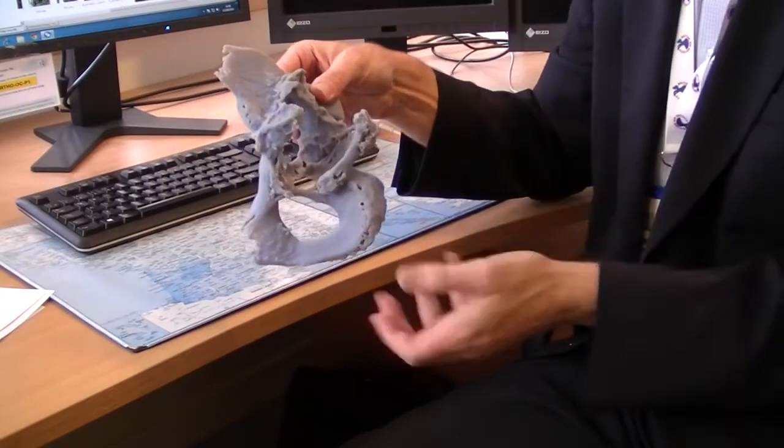So I can first of all tell, yes, I can complete the surgery and do a good job for you. And secondly, I've got a good idea of the order I would put sizes in to allow me to finish the surgery safely. So I've got an example of a 61-year-old who I operated on using the model to plan my surgery. He'd previously been involved in a road traffic accident in his 20s. He'd had a pelvic fracture, a thigh bone fracture, a shin fracture, so multiple injuries. And he subsequently had a hip replacement at a very young age in his 40s.